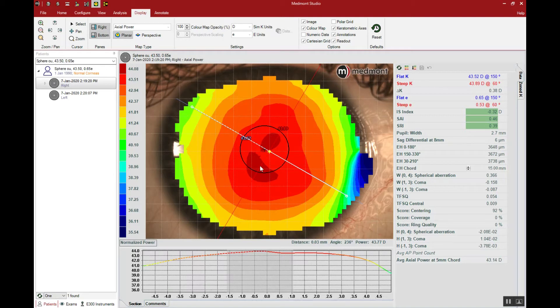What else can we look at here in the topography? Let's look at the color contours, especially toward the periphery where the lens will land. Let's follow this yellow contour where we would expect our lens to touch down and align on the peripheral cornea. Is that yellow band equidistant from the visual axis? Is the cap of our cornea displaced or symmetric and centered? Here we see a yellow or yellow-green area that looks relatively well centered laterally to the visual axis, so we wouldn't expect a high degree of lateral decentration of our contact lens. There may be some vertical displacement, but not lateral displacement based on these yellow-green contours.